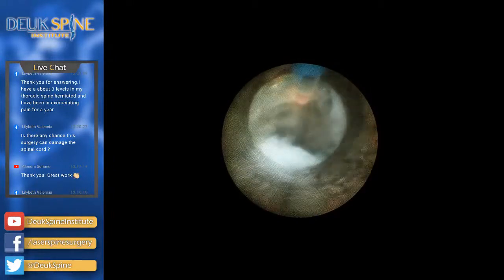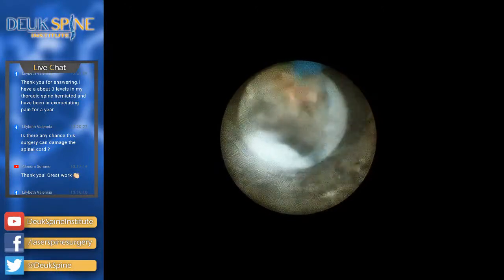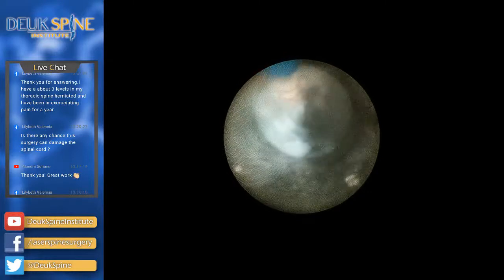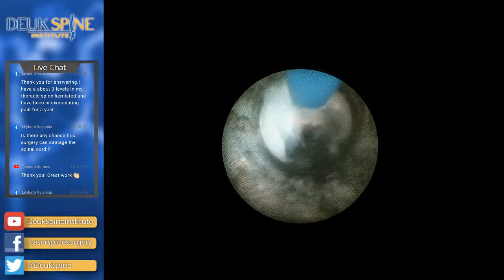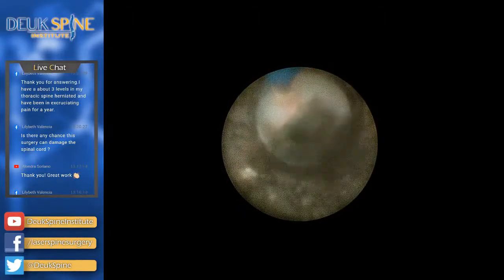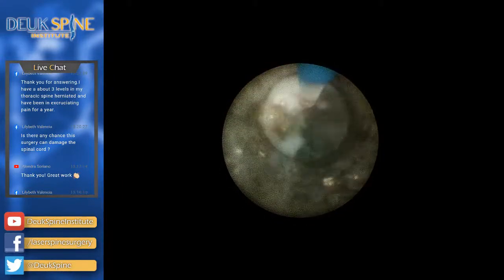This area of the disc right here has definitely got more scar tissue. You see all this stuff, the hard, whitey golden stuff, kind of a cream color? That's all collagenized herniation, and I've got to try to get it out, as much of it as I can. I'm going to go lateral as well. Remove herniation laterally. Probably got 5 minutes, doctor. A California 5 minutes.